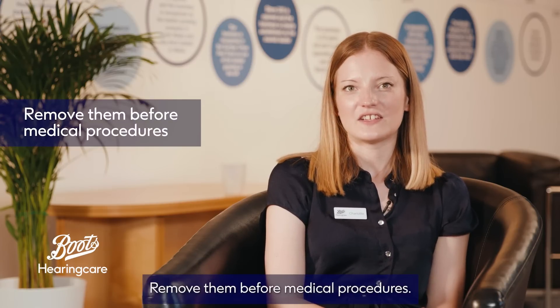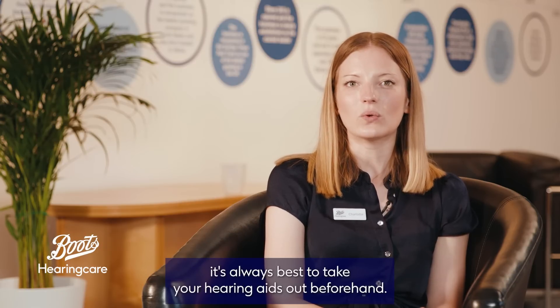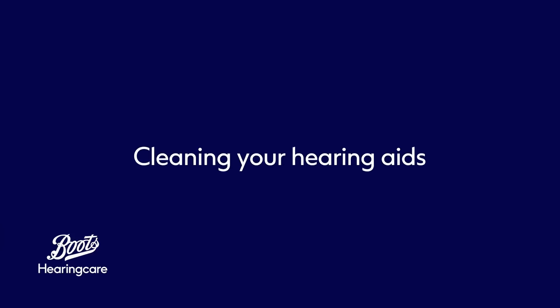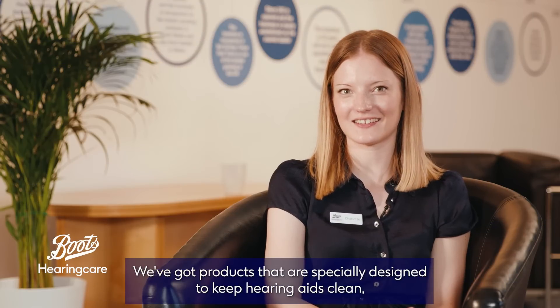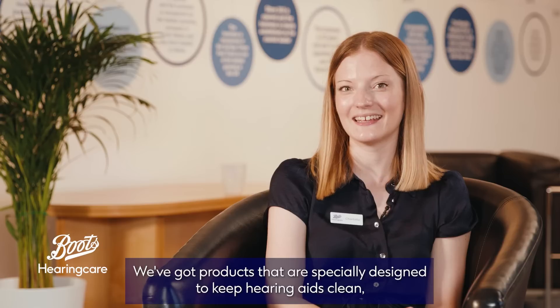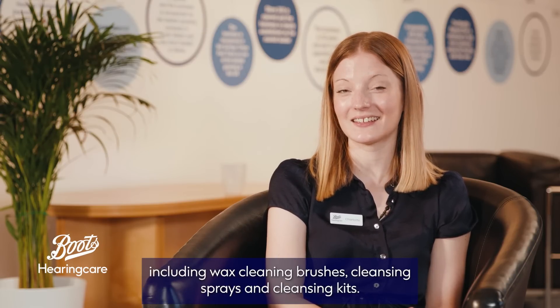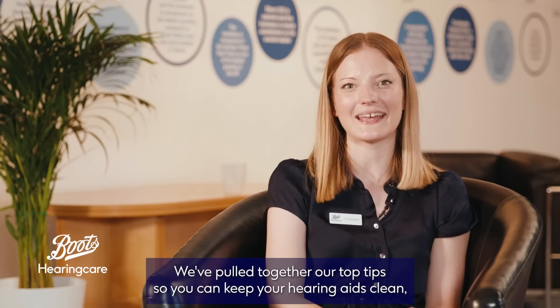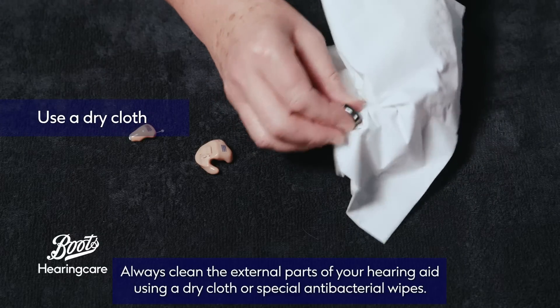Remove them before medical procedures. If you're undergoing an X-ray, MRI, or CT scan, it's always best to take your hearing aids out beforehand. We've got products that are specially designed to keep hearing aids clean, including wax cleaning brushes, cleansing sprays, and cleansing kits. Not sure where to start? We've pulled together our top tips so you can keep your hearing aids clean no matter which type you use.